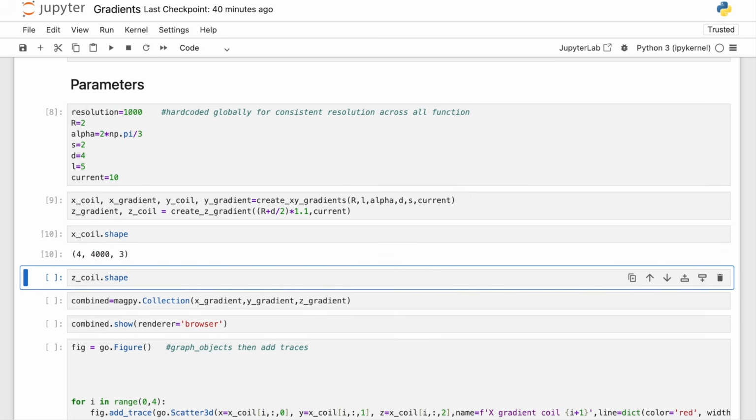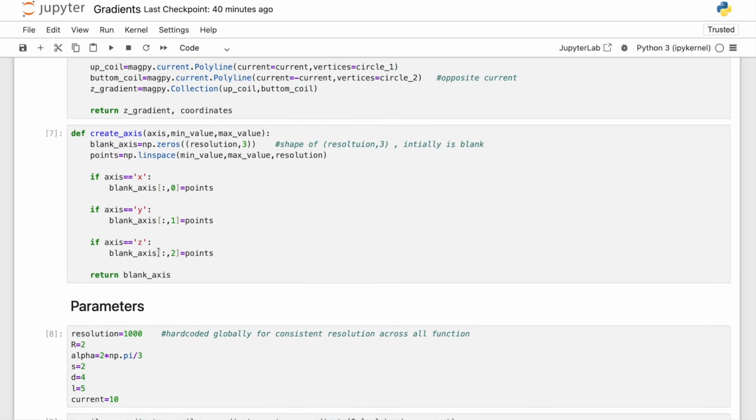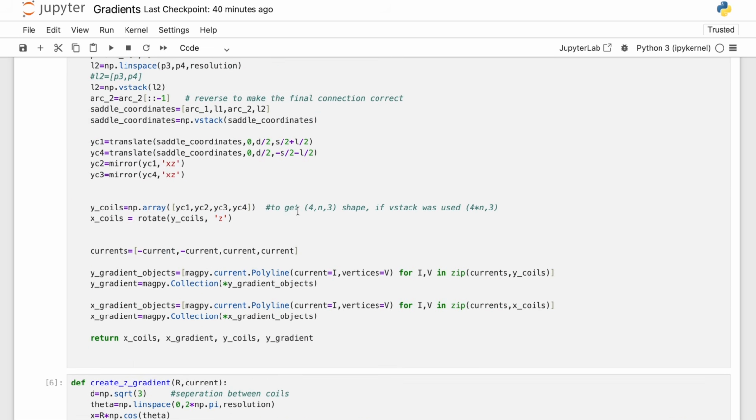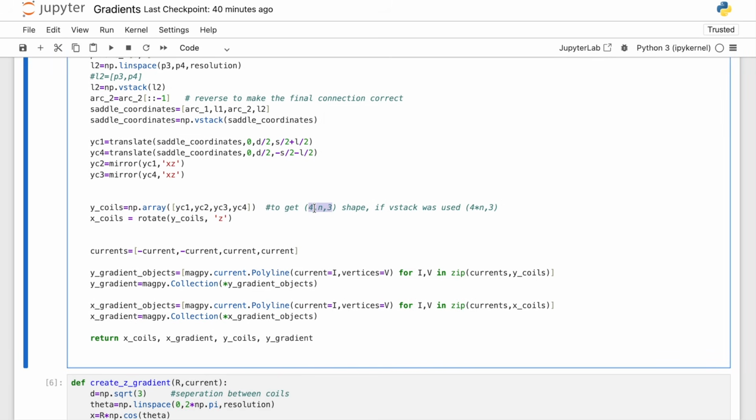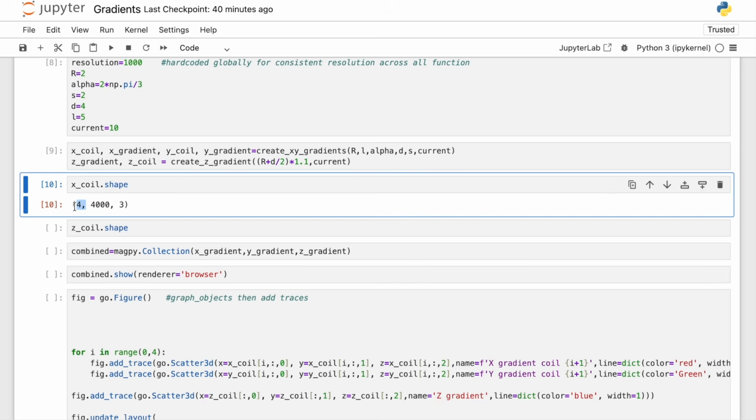Let's see the shape of x coil. This is 4 by 4000 by 3, as we expected it would be. 4 by resolution by 3, because x coil consists of 4 coils stacked on top of each other. That's why we have 4 here. So 4 coils, each coil has 4000 points. Why 4000? Because we had 2 arcs, each with 1000 points, and 2 lines, again each with 1000 points, and all of them respectively had 3 points, so 3 coordinates.